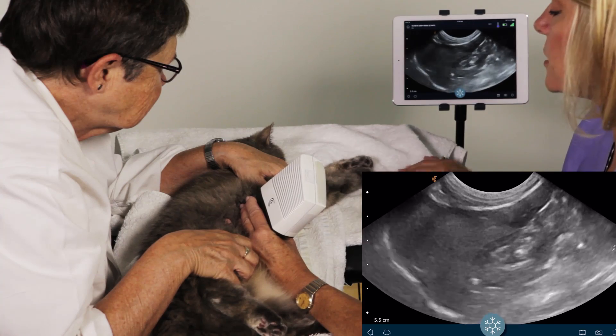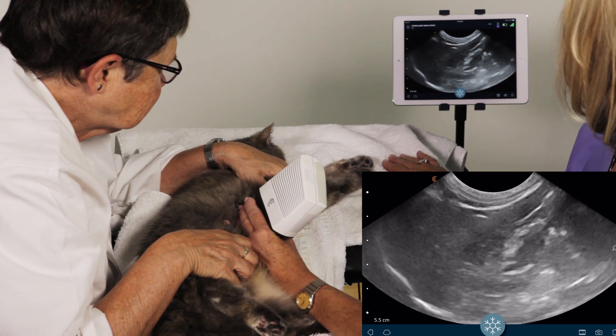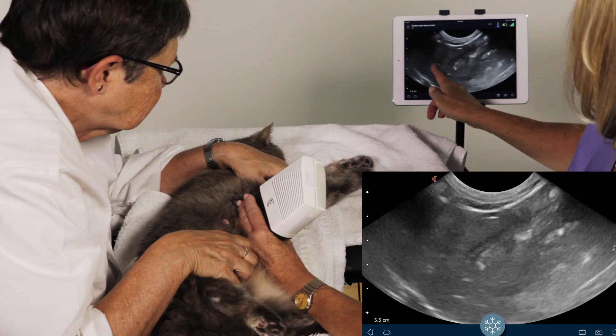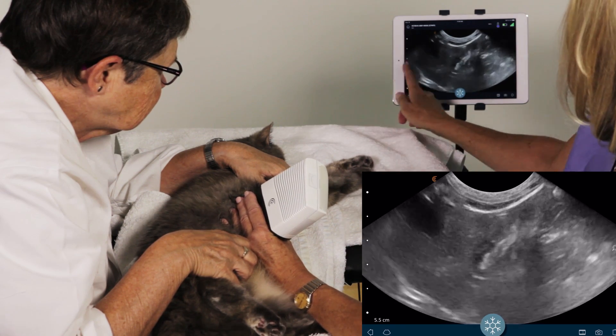There we go. Orientation is to her head, correlating with our C for Clarius. Here's her liver tissue and her gallbladder.